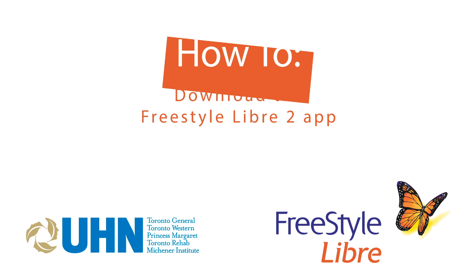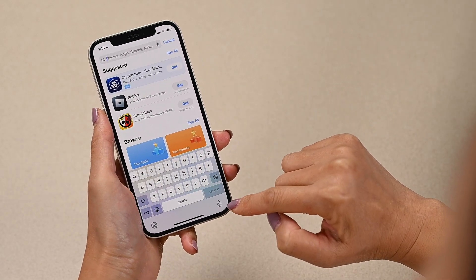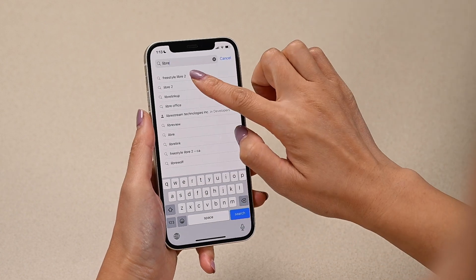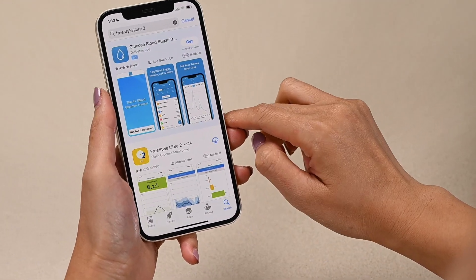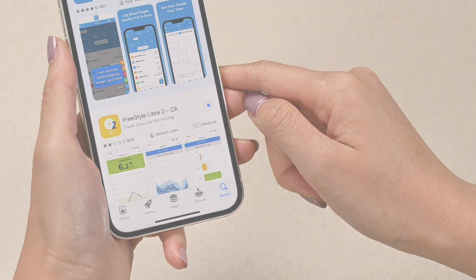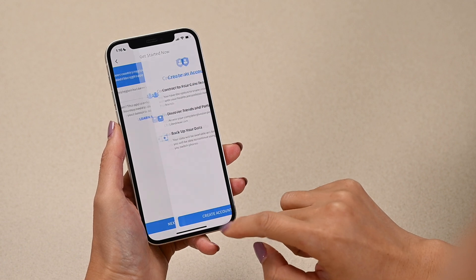How to download the Freestyle Libre2 app. Open the iPhone App Store or Google Play Store on your mobile phone. Search for Freestyle Libre2 and install it. Once installed, open the app and follow the prompts to create an account.